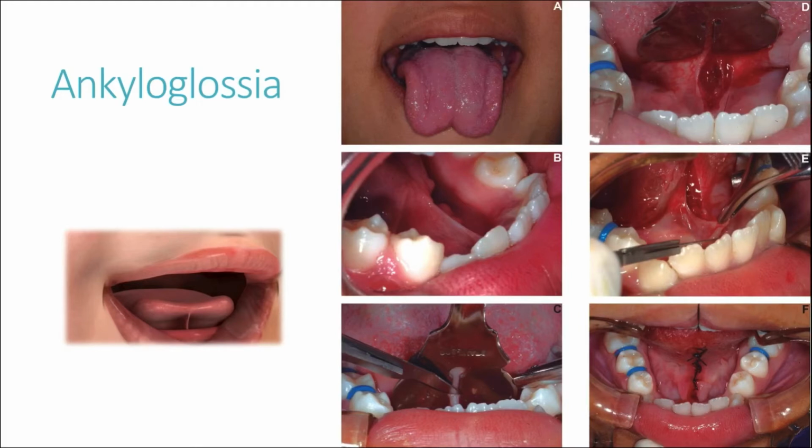In 2011, they reviewed diagnosis and treatment of ankyloglossia and tied maxillary frenum, first using the diode laser, 1064, and the Er:YAG laser. This laser treatment corrected abnormalities; in fact the patient was comfortable, for relief and to improve pain-free breastfeeding without any need for an operating room or general anesthesia.